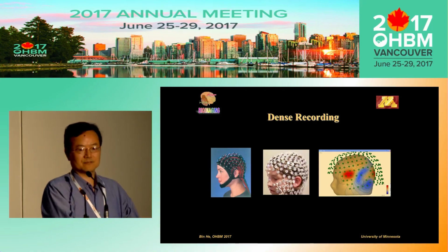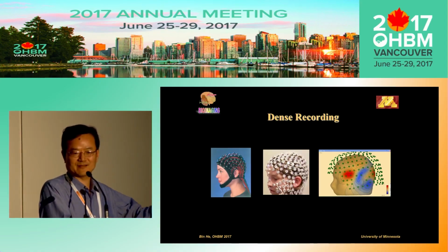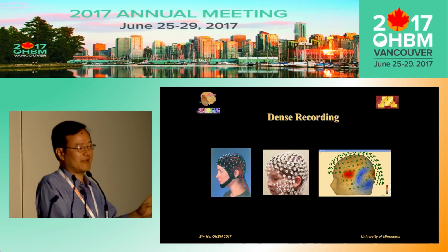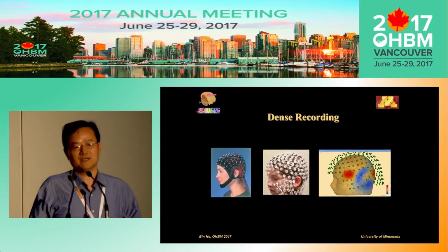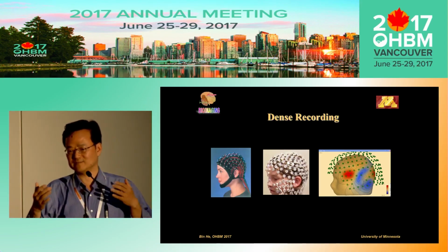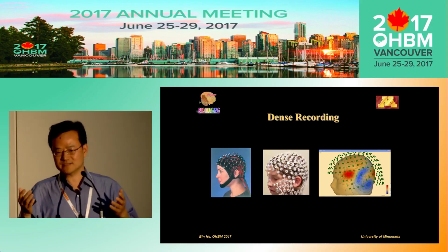So I want to make a claim that this list is not inclusive at all. I made this slide this morning, and I got up at 6 o'clock and tried to do a final touch on my slide. So I just went to the Google website and grabbed some pictures available. I know there are many other companies available these days, but it does give you a basic flavor that you use either high-density EEG recording or high-density MEG recording. Now, the good thing, I think the success of the MEG community is that virtually all the MEG devices, because of the cost, of course, are high-density.